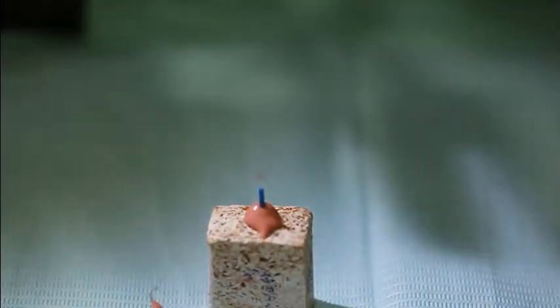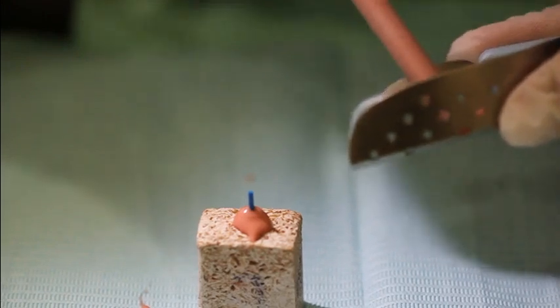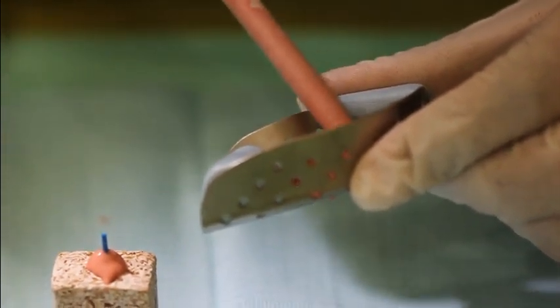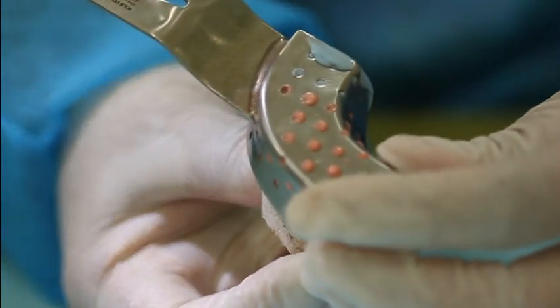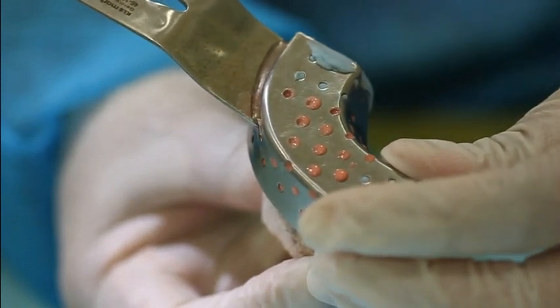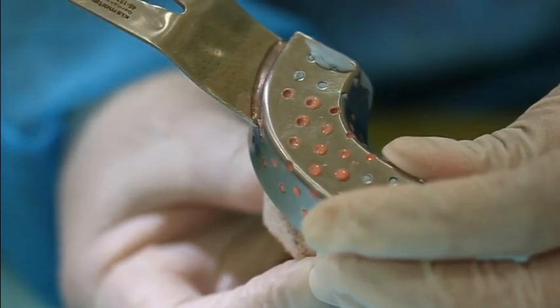At the same time, your assistant needs to load the remaining material, the medium body, inside the stock tray. Okay, in the patient's mouth, make sure you hold your tray firmly and make sure it's stable, and wait until the material is fully set.